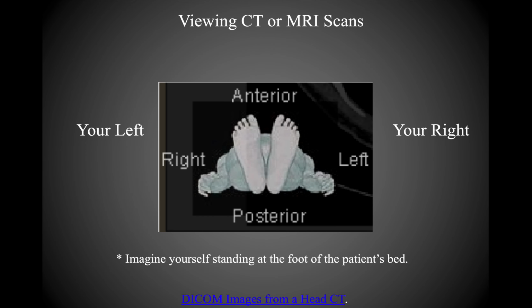So just a couple of notes in terms of the way that we view CT scans. CTs are presented as a series of slices that you can view by scrolling through the images on a DICOM viewer. So we'll jump into a DICOM viewer here in just a moment. But DICOM stands for Digital Imaging and Communications in Medicine. It's the standard format used for medical images.